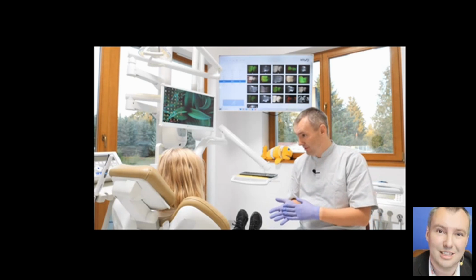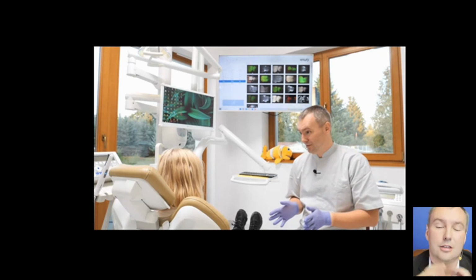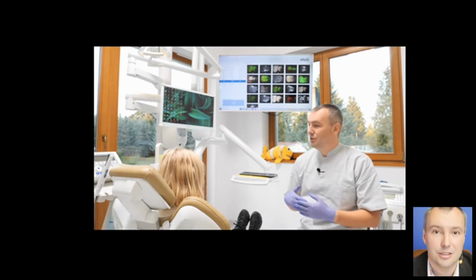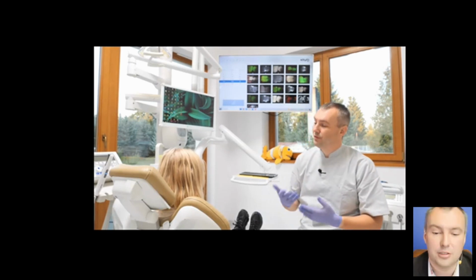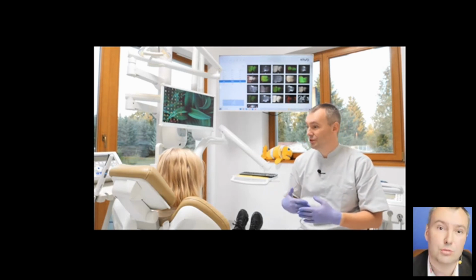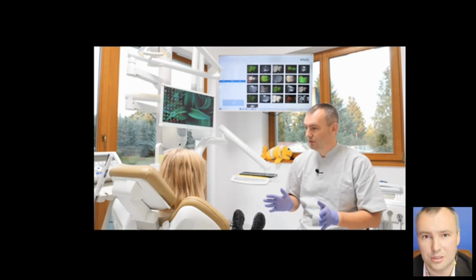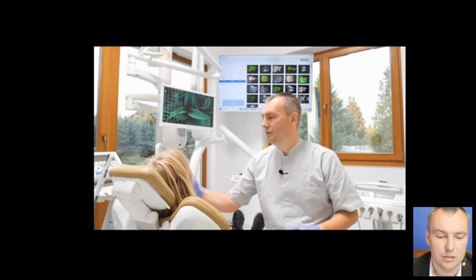Now we will use the laser device to see if there are any problems with the teeth. The examination will be completely painless. I will use just a mirror and a special laser device. The laser is very weak, so it's completely safe. Afterwards, we will see some images which will look like X-rays, but it has nothing to do with röntgens. There is no radiation. It is completely safe. Don't worry. Then we will discuss the outcome and see what is going on.